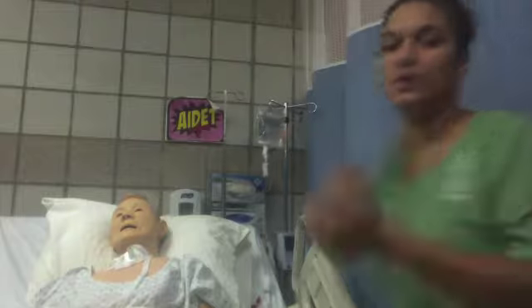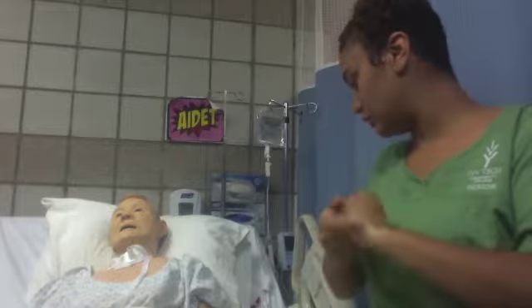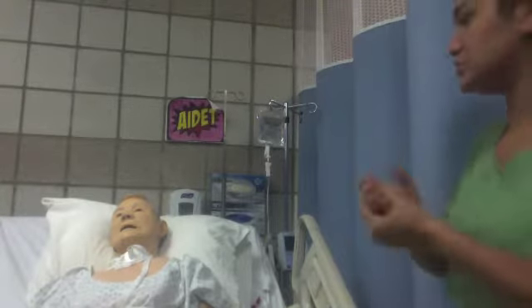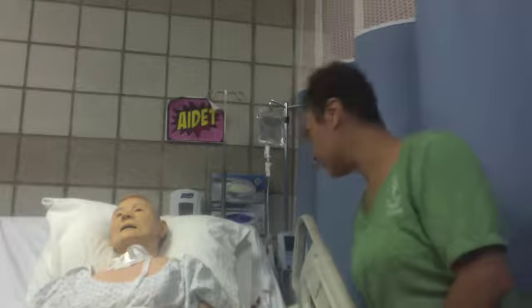Okay, so now I'm just going to, already done that. All right, so I'm going to explain the blood procedure. So we will be doing, I'm going to put this down so I can talk to you a little better. I've already raised the bed up, I've already had him sit up so we can communicate better. I've already verified any needs, any previous reactions or allergies that have been had.